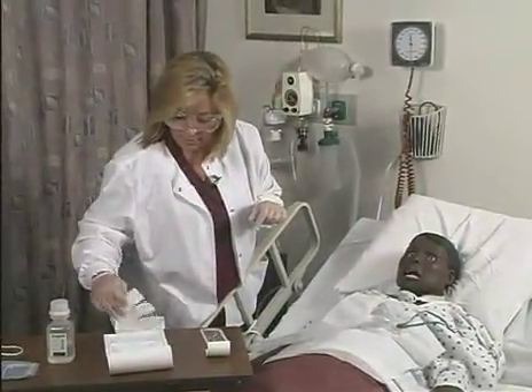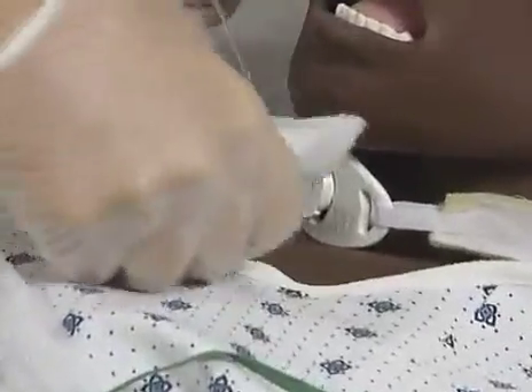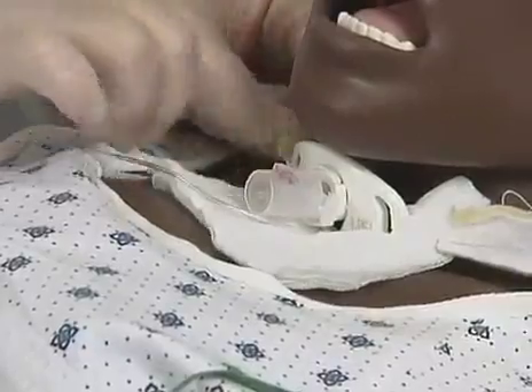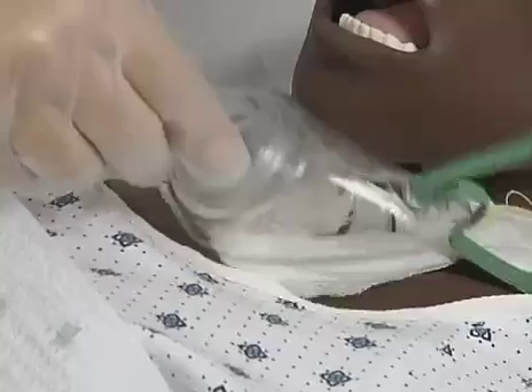The next step would be to apply a new drain gauze dressing around the trach. I'm just going to put this new dressing on, Mrs. Jones. There, how does that feel? And I'm going to apply the tracheostomy mask back on, Mrs. Jones. You did very well.